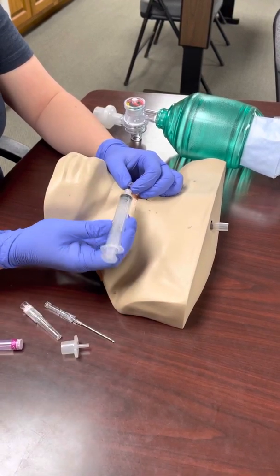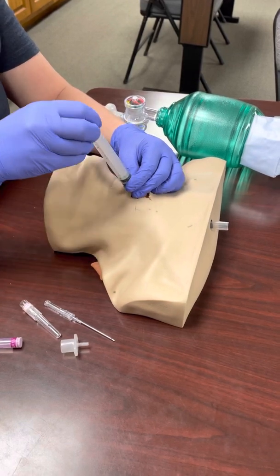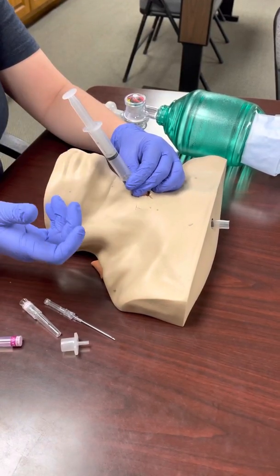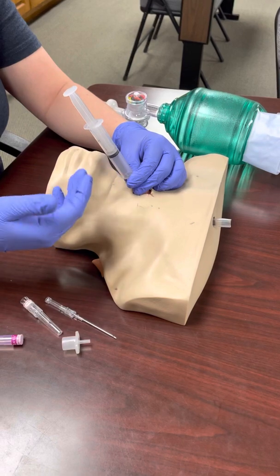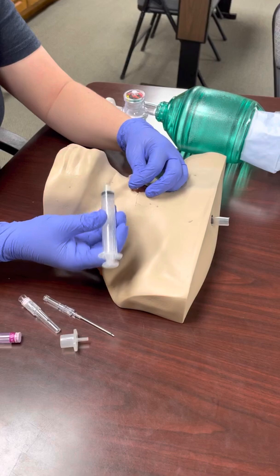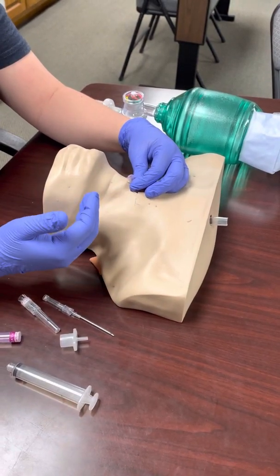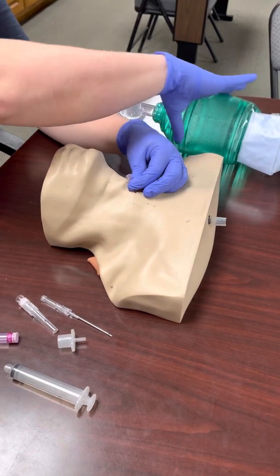To confirm good placement, you have the option to hook up a 10cc syringe and draw back. You should get air, or air mixed with blood since this can cause a little bleeding. That's up to you. Just make sure if you do that, you're holding very tightly onto that needle cath because it's going to want to naturally push out — make sure you're not letting go.